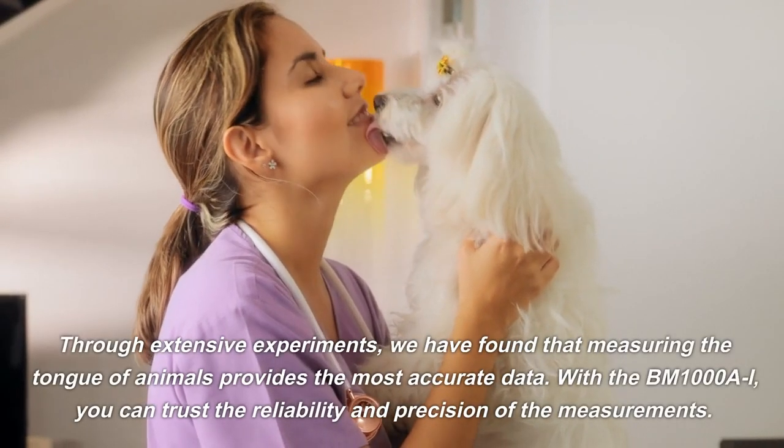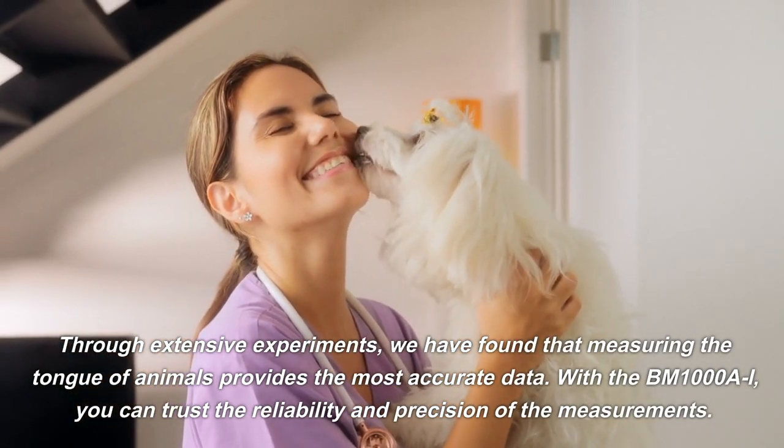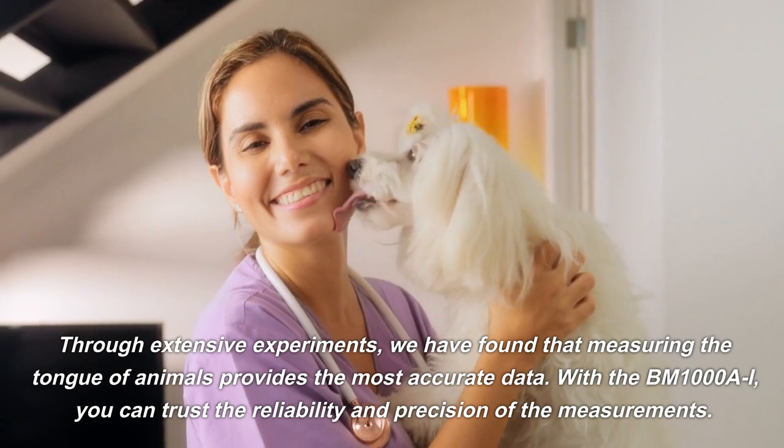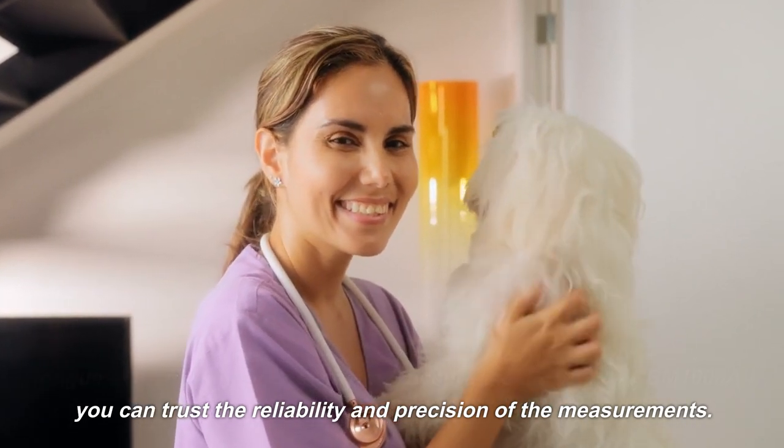Through extensive experiments, we have found that measuring the tongue of animals provides the most accurate data. With the BM1000AI, you can trust the reliability and precision of the measurements.